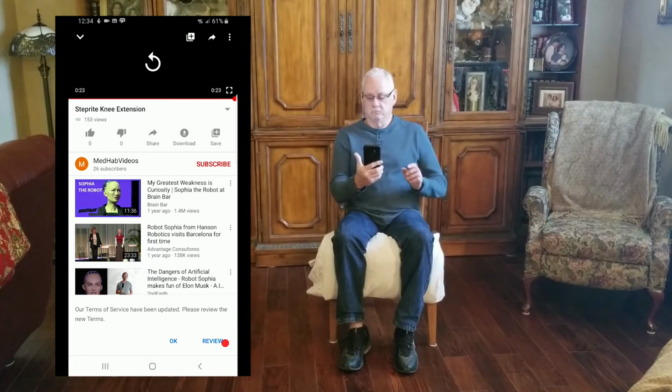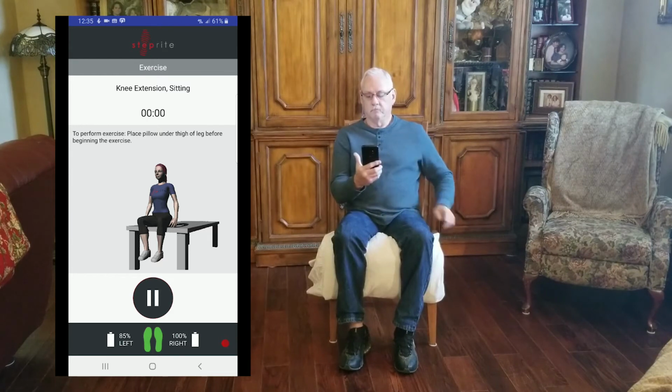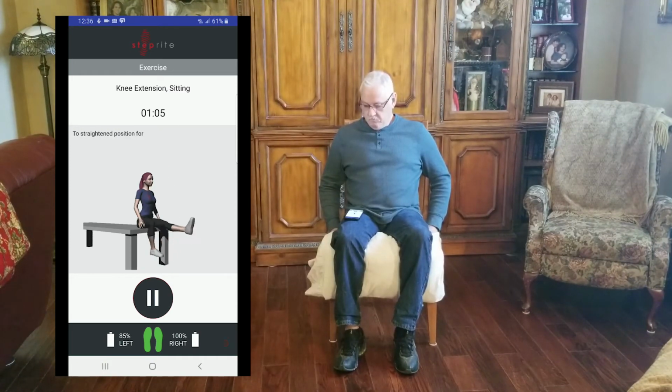You then hit the back button on the app and it advances you to this screen where you will see the 3D animated image. Here you can listen to the verbal cues as well as watch her to be in sync with the exercises pursuant to your doctor's orders. In this case here, it is the left leg and 3 repetitions.